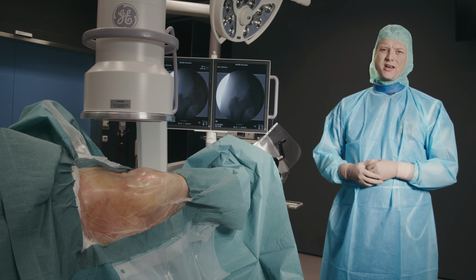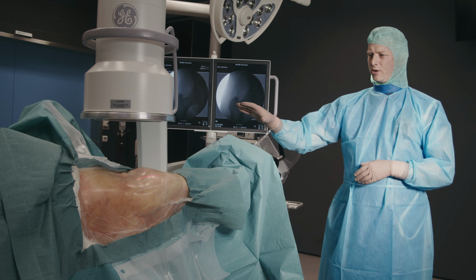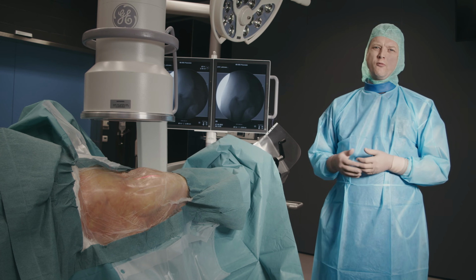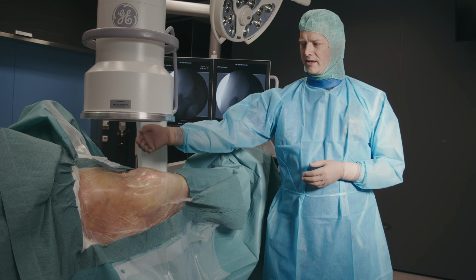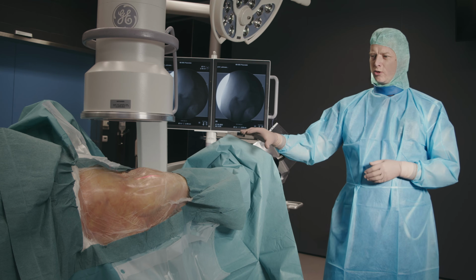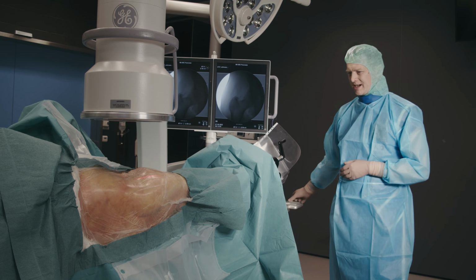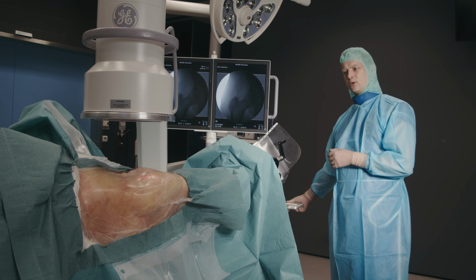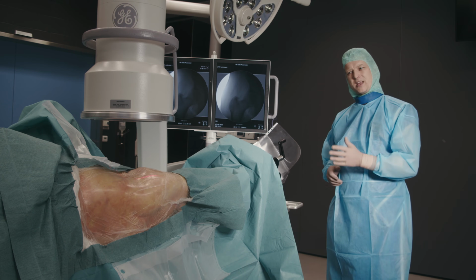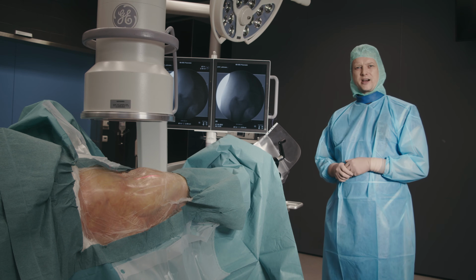A key issue in osteosynthesis of a hip fracture is proper reduction. Before starting the draping, it is important to make sure you get good fluoroscopic images of the hip with the C-arm in both AP and lateral view. Fracture reduction is performed before draping. The traction table allows adjustment of traction as well as rotation of the limb. It's essential that the leg is brought into slight adduction in order to allow successful insertion of the nail from the tip of the greater trochanter.